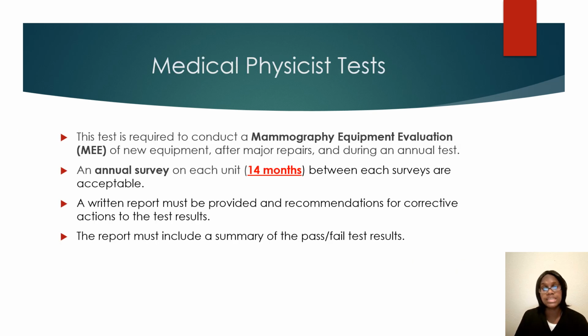For the medical physicist test, this test is required to conduct an MEE, or mammography equipment evaluation, of new equipment, after major repairs, or during an annual test. An annual survey on each unit is required; 14 months between each survey is acceptable.